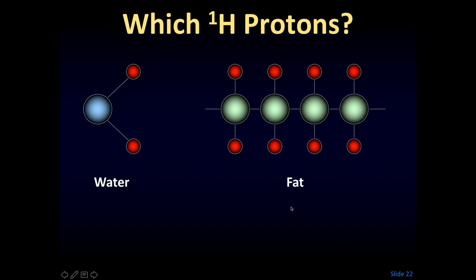But which hydrogens? Any hydrogens? I mean, are we looking at the hydrogens in proteins? Are we looking at the hydrogens in the DNA? What hydrogens are we looking at? Turns out, for clinical care, we're looking at 2 hydrogens only. We're looking at the hydrogens in water.